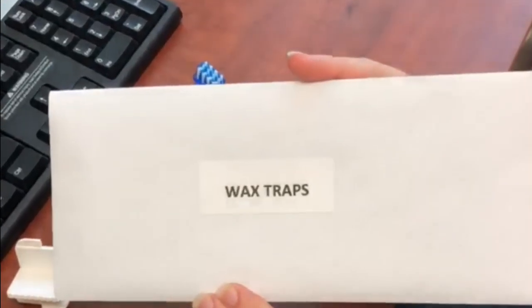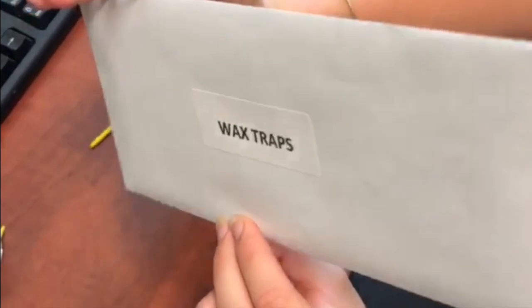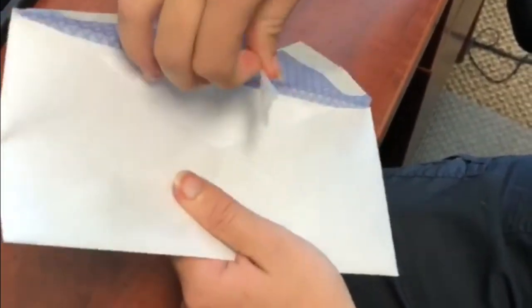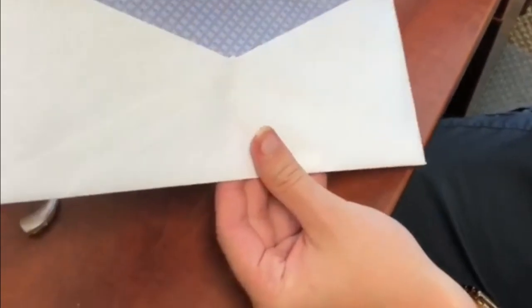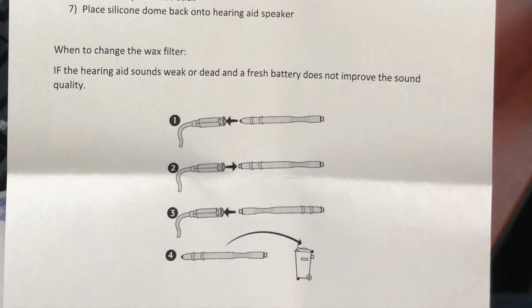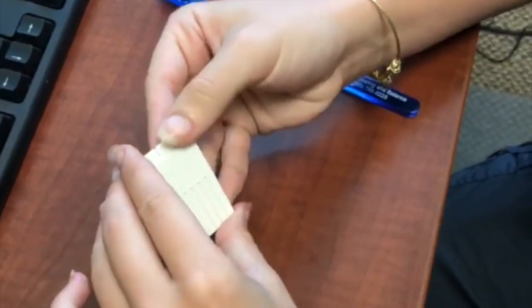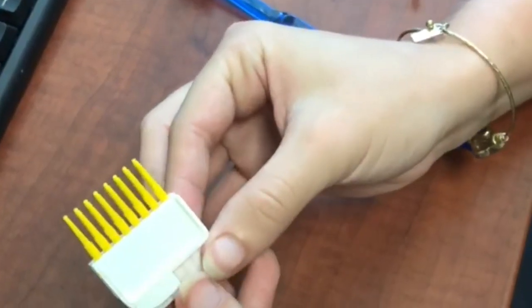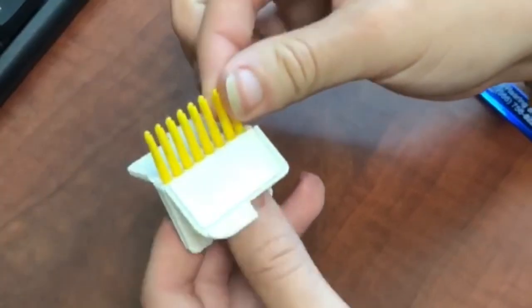When you were first fit, you should have received an envelope labeled wax traps. Inside of this envelope is an instructional piece of paper on how to change your filters. And just one more time to go over how to properly insert and remove the filter from your device.